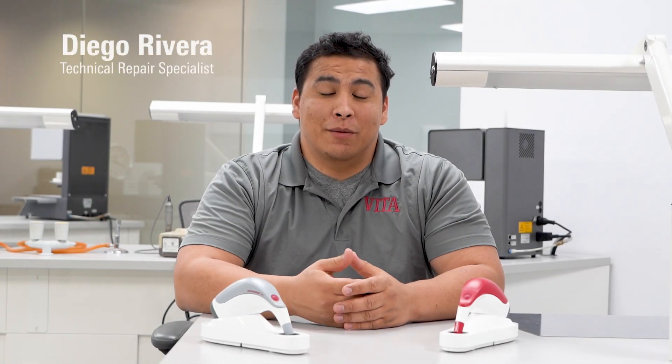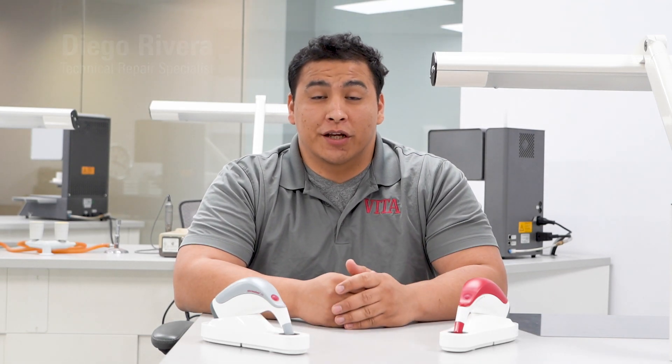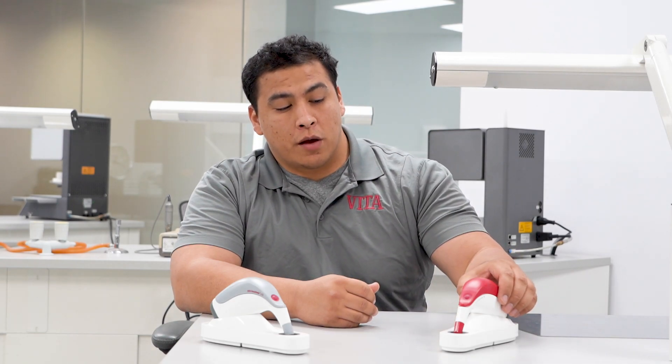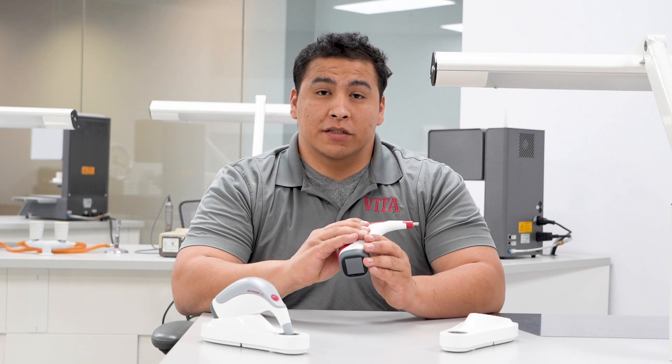Hi, my name is Diego. I'm a repair specialist at Vita. Today we're here to discuss the Vita EasyShade Lite and the Vita EasyShade 5 with you. We just want to go over some common questions people have, one of them being regarding the batteries inside these units.